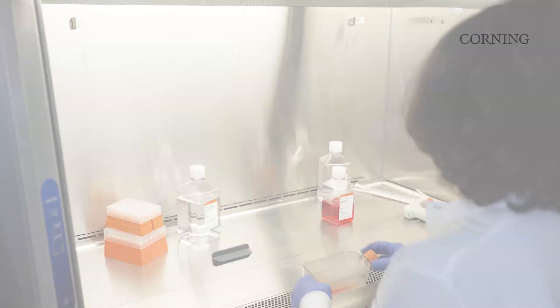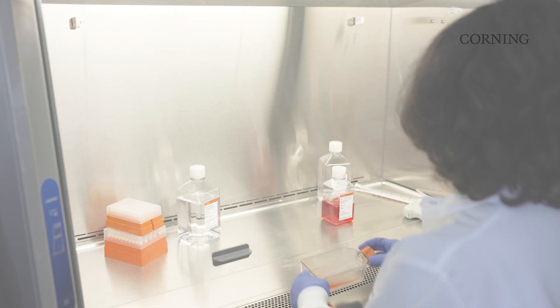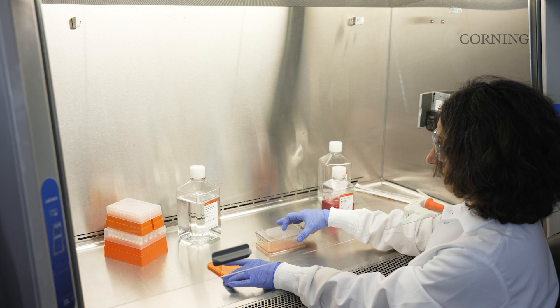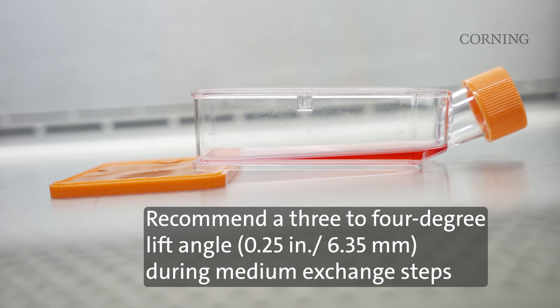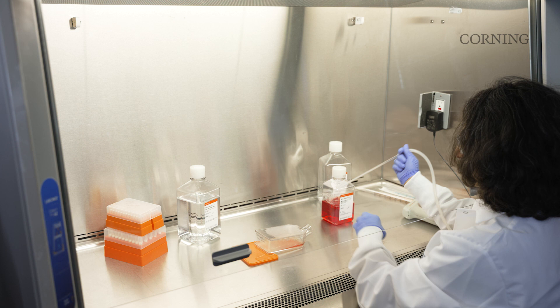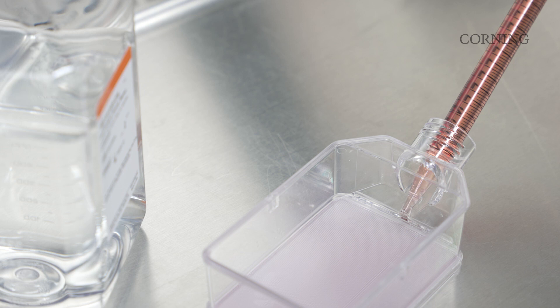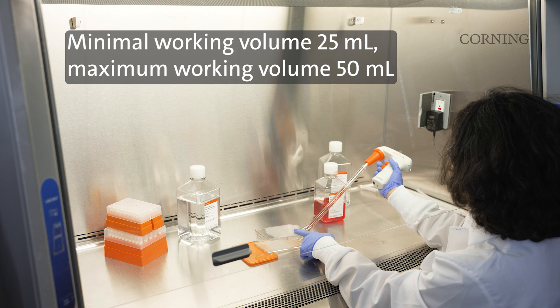During medium exchanges, the canted neck and liquid diverter feature allow for gentle flow of medium into and out of the vessel. Lifting the back end of the flask three or four degrees drives the liquid towards the diverter feature in the canted neck to enable full liquid removal. To remove spent medium, place the pipette tip up against the diverter feature and begin to aspirate. To replace medium, place the pipette tip up against the diverter feature and slowly add fresh medium. A working volume of 25 to 30 milliliters is recommended; however, optimal final volume will depend on cell type and feeding schedule.